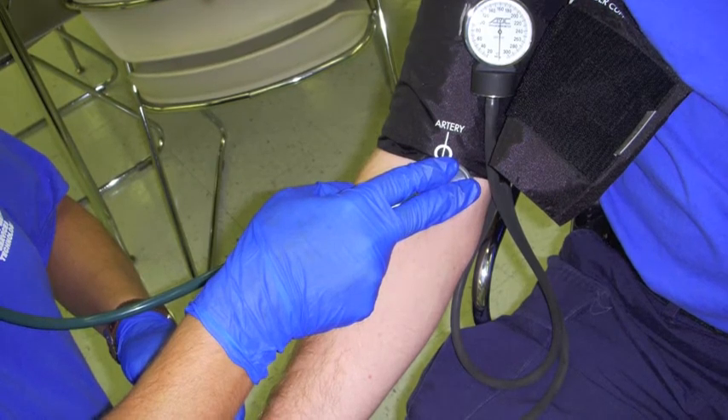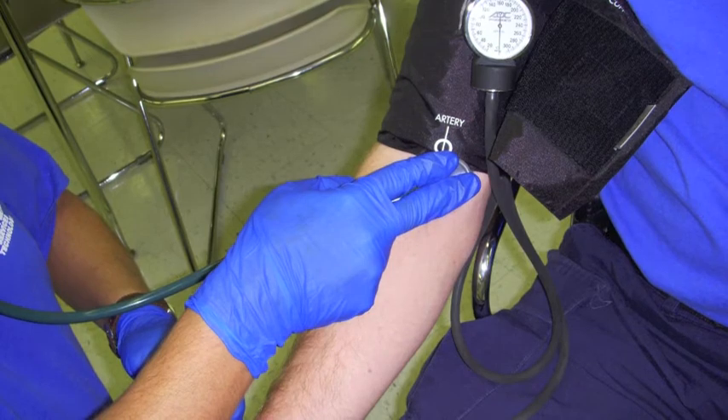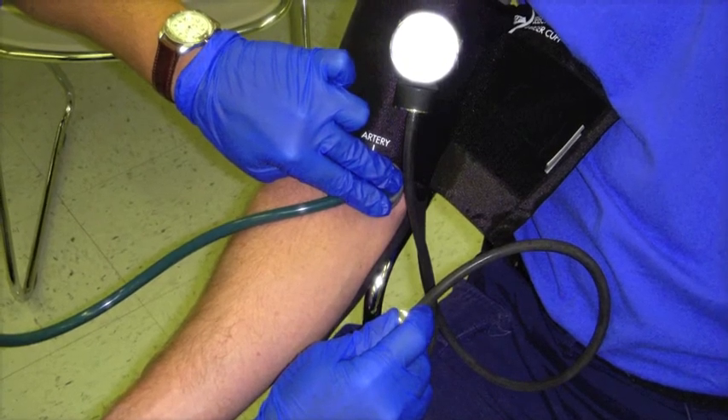Pump to 20 mmHg above the pulse point where sound stops. Note systolic and diastolic pressure as you let air escape. Open the valve and quickly release remaining air.